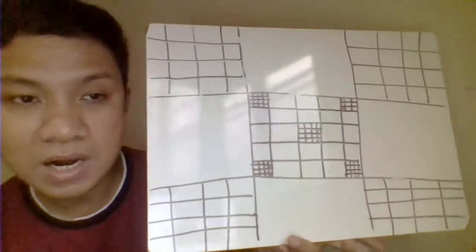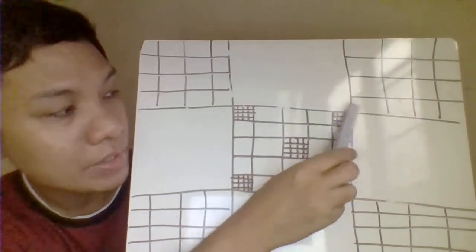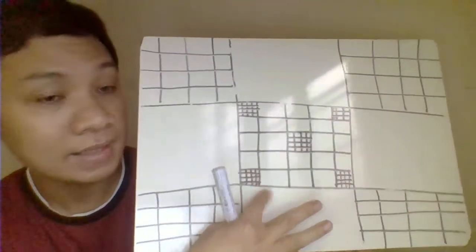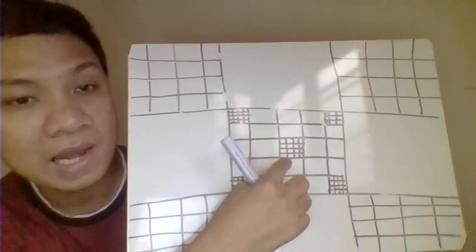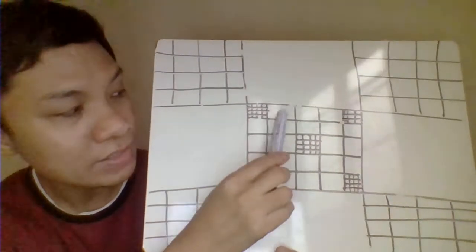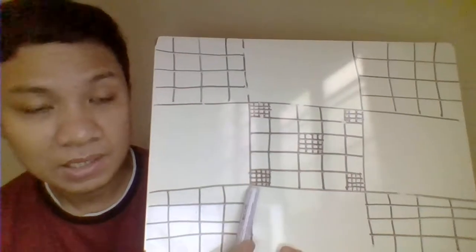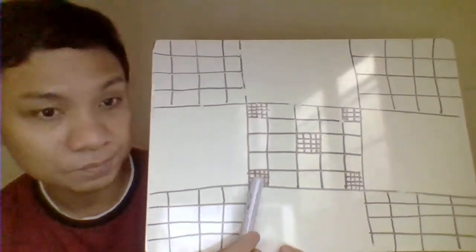So usually when we are doing your RBC count, we count in the central square. We count the 4 corner squares of the central square plus the very central square. Each of those contains 16 smaller squares. The ones I did not draw lines on also look like this, divided into 16 smaller squares.